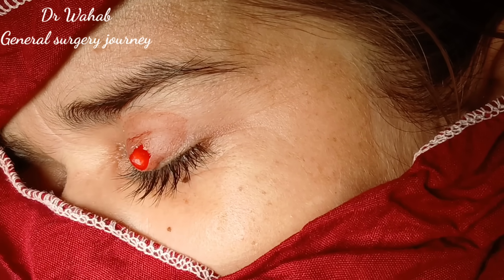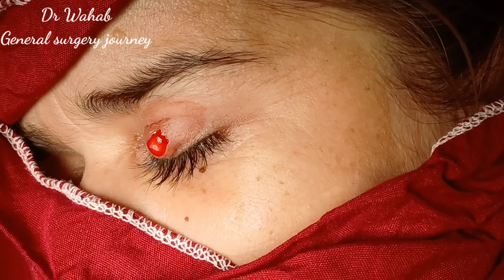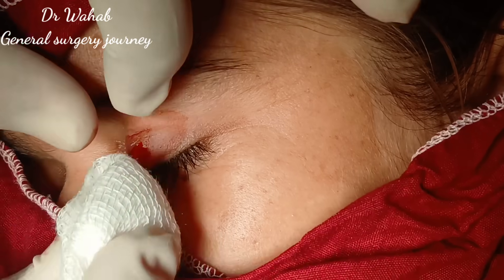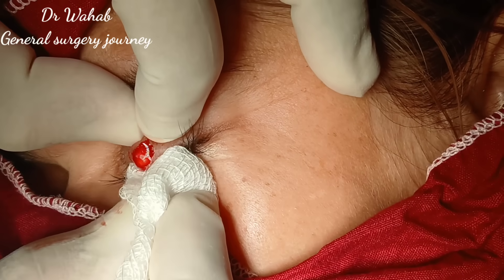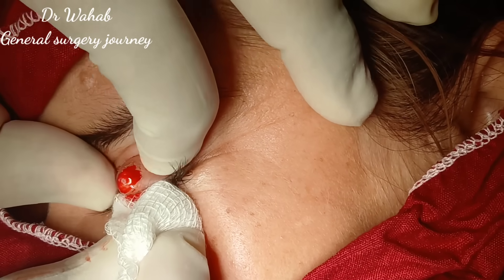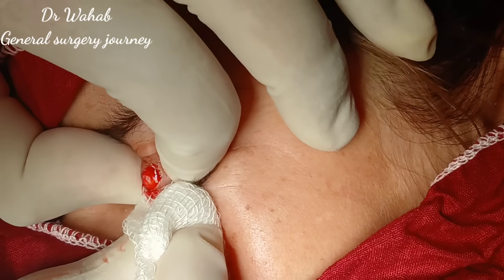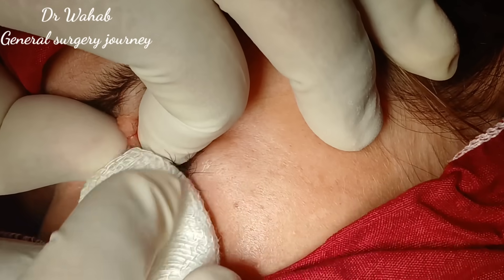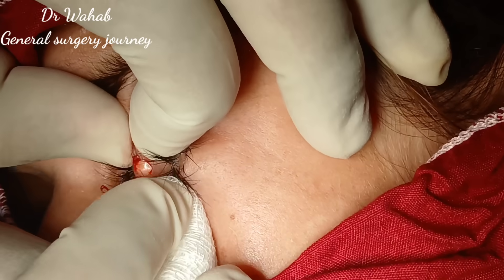Now we will do blunt and sharp dissection circumferentially around the cyst. It is stuck inside.